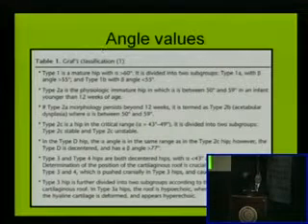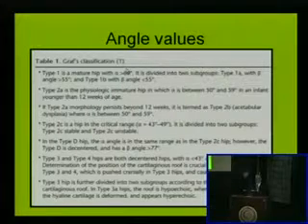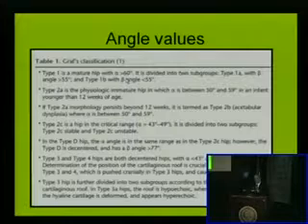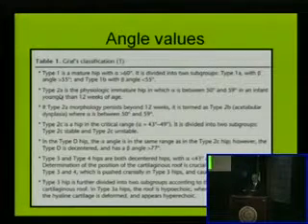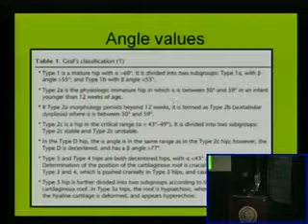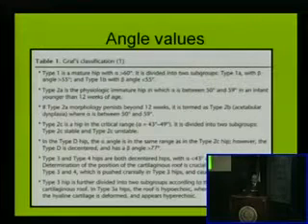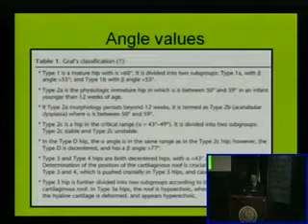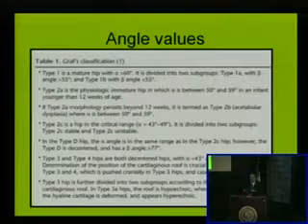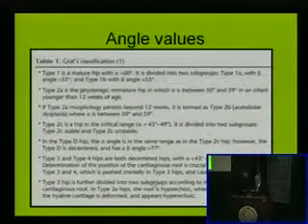Here, of all the angles described by Graf, we can remember from all these values only some measurements. Like the normal alpha angle, it should be more than 60 degrees. That will form a good cup of the spoon to lodge the ball inside. Type 2A is between 50 and 59. In this category, if it is after 3 months, it is considered as mild dysplasia. If before 3 months, it is considered as immature hip. In type 3 and 4, these all are decentered hips, either subluxated or dislocated hip. Type 3 is sometimes divided into A and B.